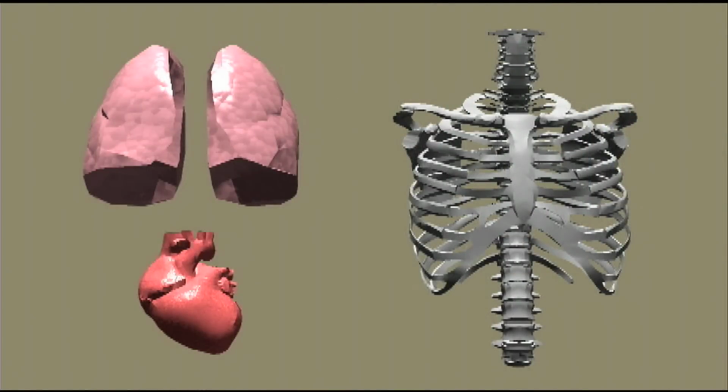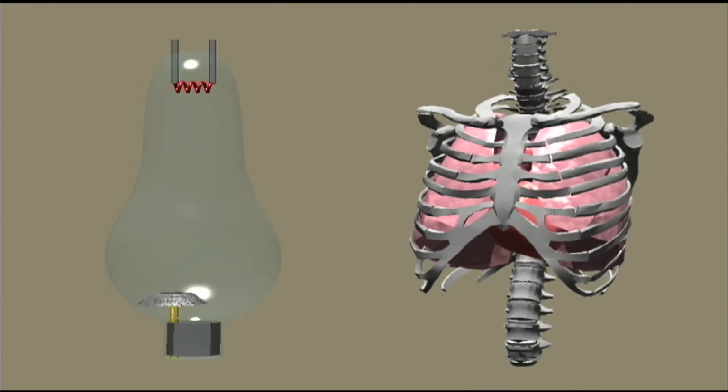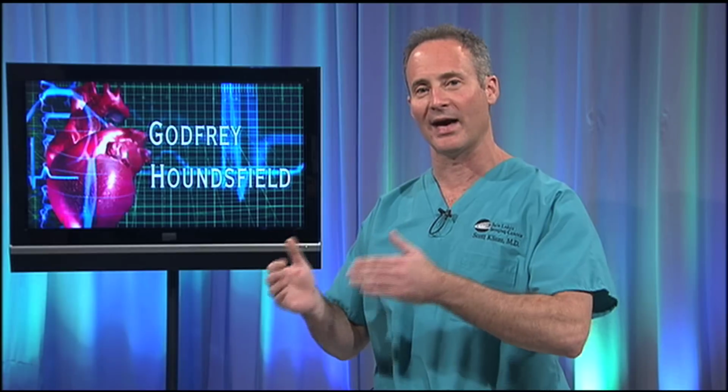society. As I said previously, there are limitations to standard radiology. You've got a 3D image, you're taking an X-ray, all those 3D objects are superimposed onto a single 2D sheet of film, so they're all piled on top of one another. Hounsfield recognized these limitations, and he felt that he could possibly impact this particular field by using a computerized technique to reconstruct an image by taking multiple radiographic images around that object.